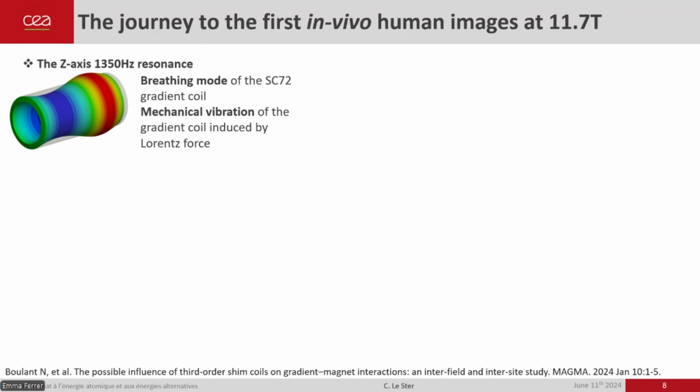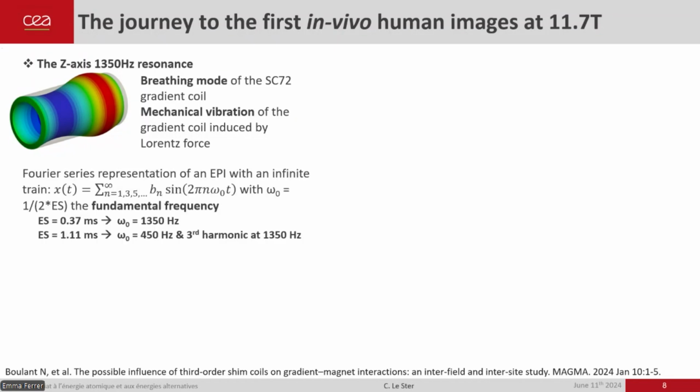This 1350 Hz resonance is called the breathing mode of the scanner, and it's caused by a mechanical vibration of the gradient due to Lorentz force. And we are going to see here just a small example of why this is an issue.